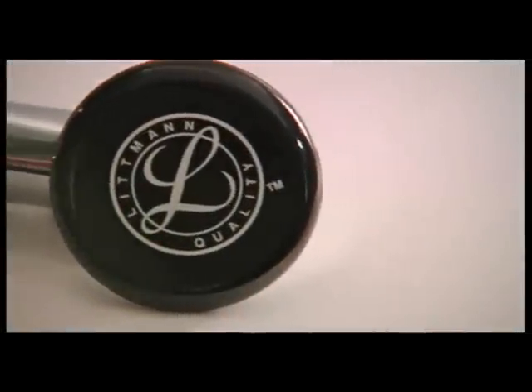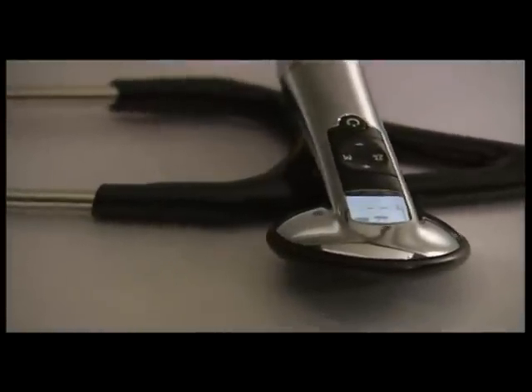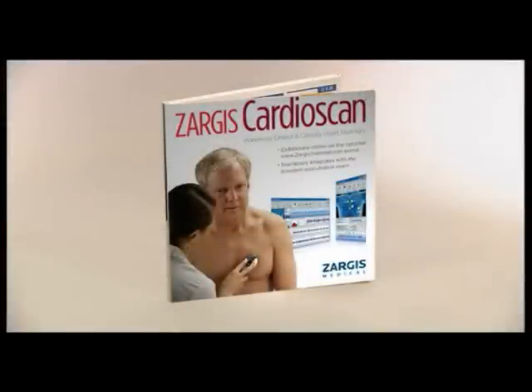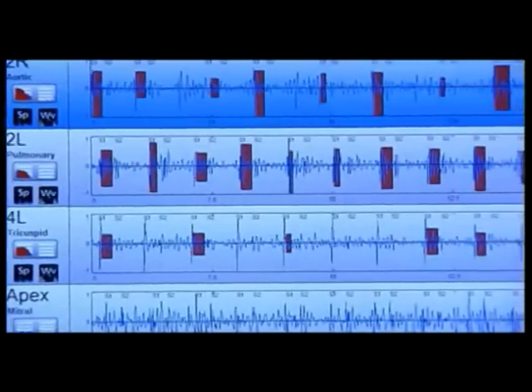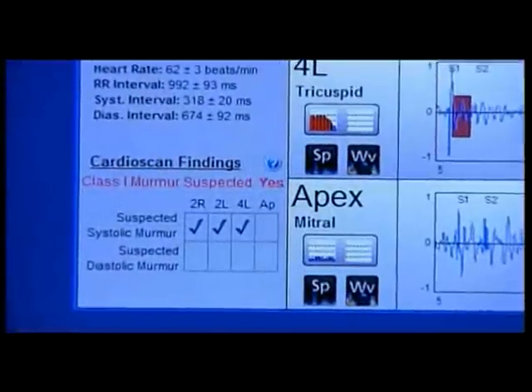The following is a demonstration of the 3M Littmann Model 3200 electronic stethoscope with Bluetooth technology and its companion Zargis CardioScan heart murmur detection software. With the Bluetooth technology built into the Littmann Model 3200 stethoscope, you are now able to wirelessly transfer and view sounds real time as you auscultate your patient. With the Zargis CardioScan software, you can now detect suspected heart murmurs with a Class 1 indication for echocardiography referral.